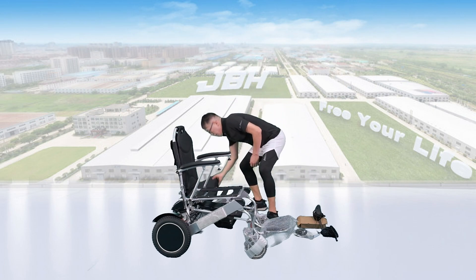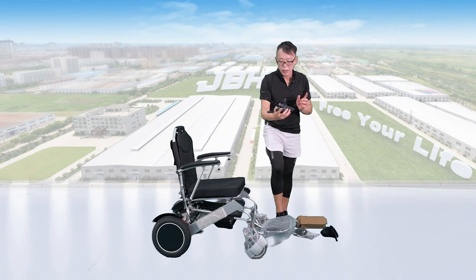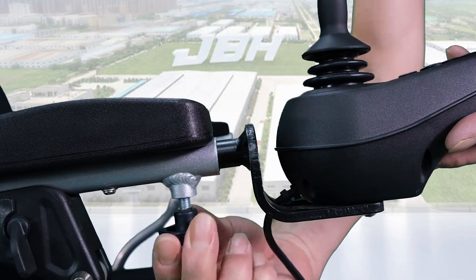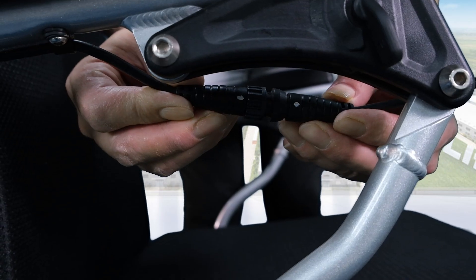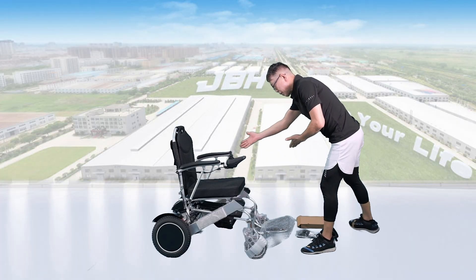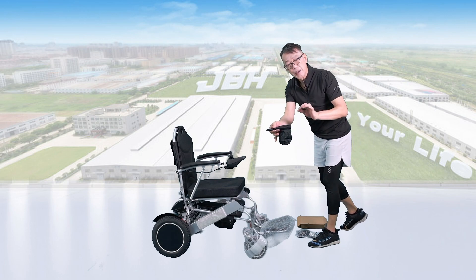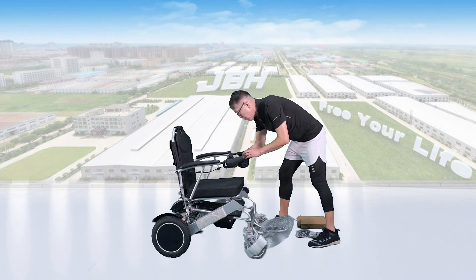Then let's set up the seat cushion on top of the seat. Take out the controller, insert it inside here, turn it to tighten, and connect the wire. You can set it for either side depending on your preference. And then on the other side, you can have the cup holder set up here.